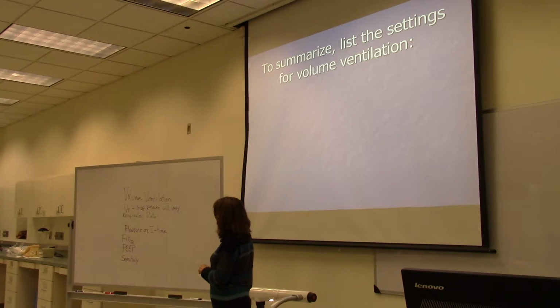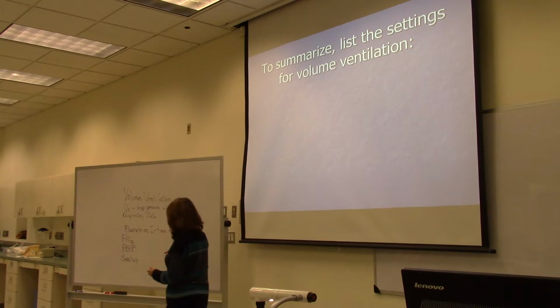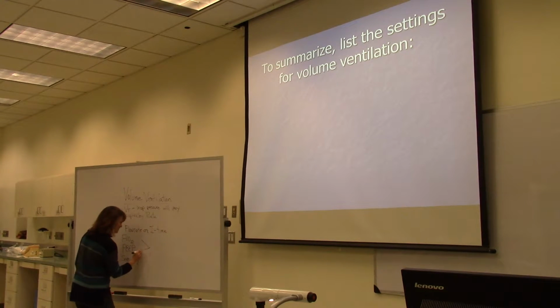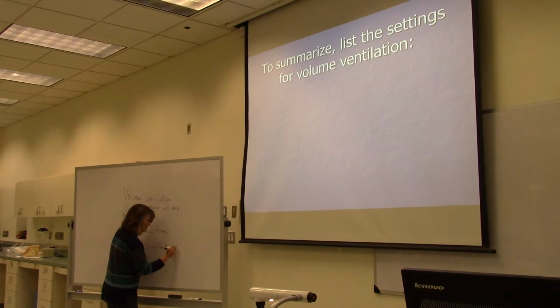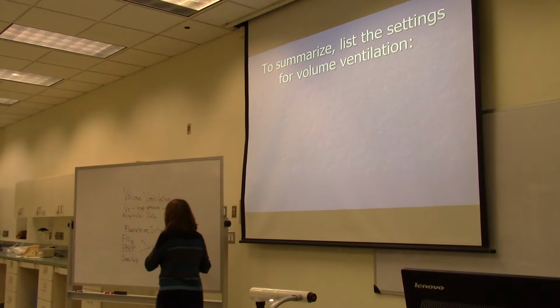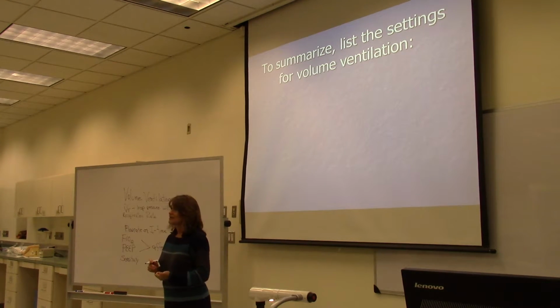All right, so of all of those settings, which settings control oxygenation? FiO2 and PEEP. Okay, and then what two settings control ventilation? Respiratory rate and inspiratory flow rate. Tidal volume and respiratory rate. Does everybody agree? Yes.